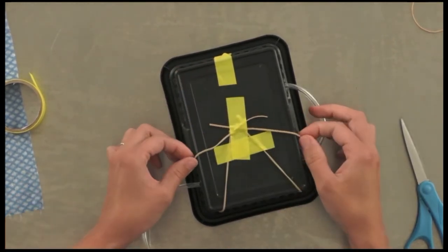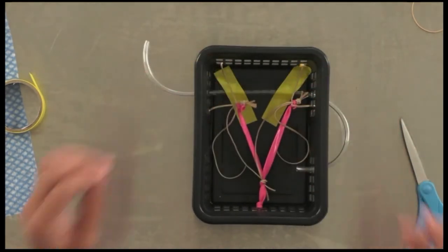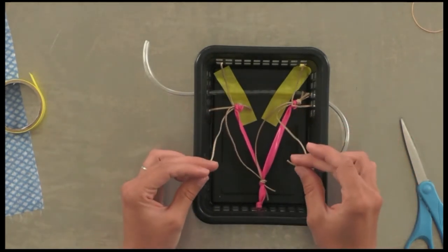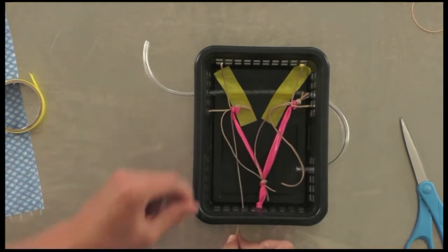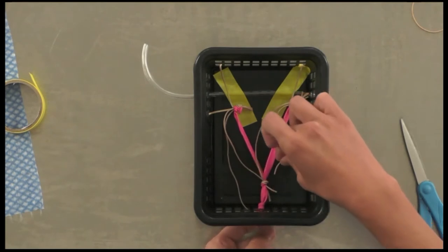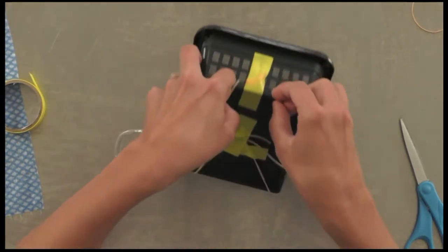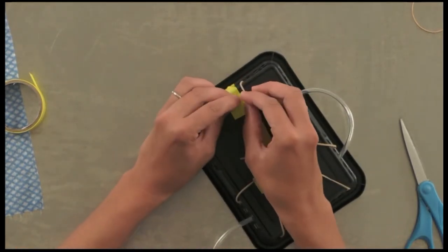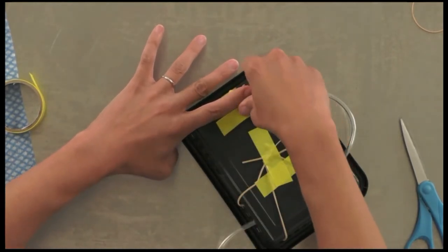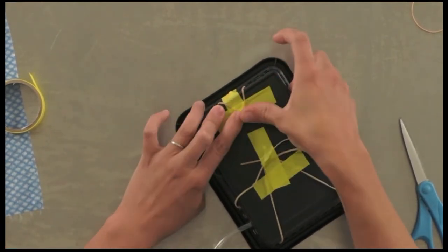The last thing to secure are the round ligaments, which travel in the broad ligament and insert around the uterine body. To simulate that, put them through the more caudal aspect of the basket. These ones you want to be a little bit taut — the same tautness as your suspensory ligaments, since ligaments are usually holding things and therefore taut.